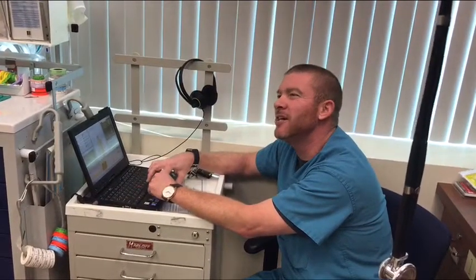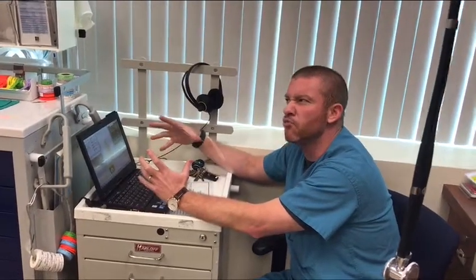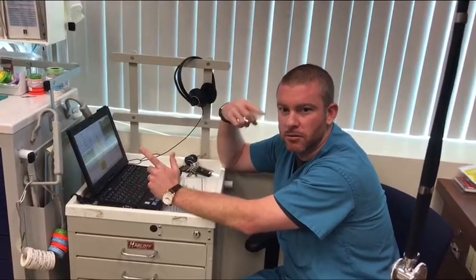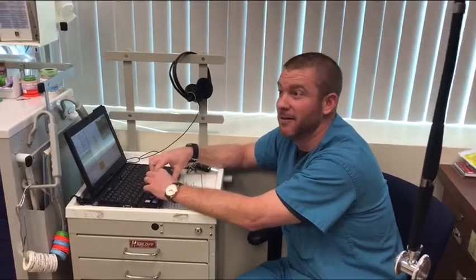I have to increase my pressure. What else is going to be very hard? What's going to be going on? They put that intra-abdominal pressure on. We're going to train our ear to listen to the monitor, because we've got one person who gets what's going on with the monitor, and that's it. We're going to decrease the preload.